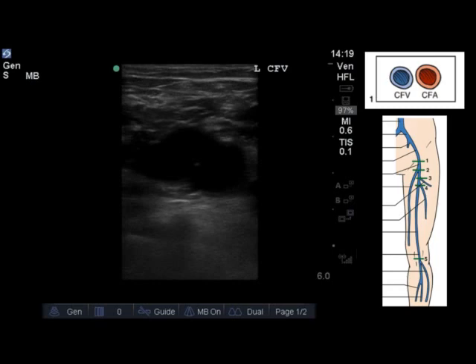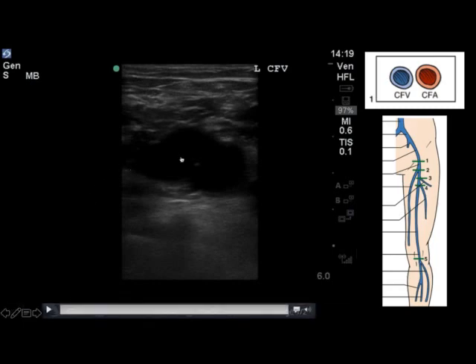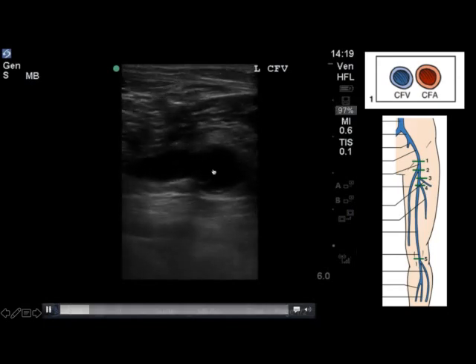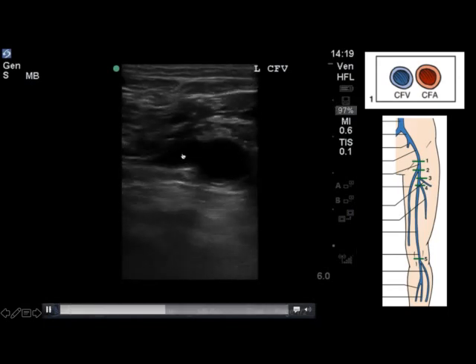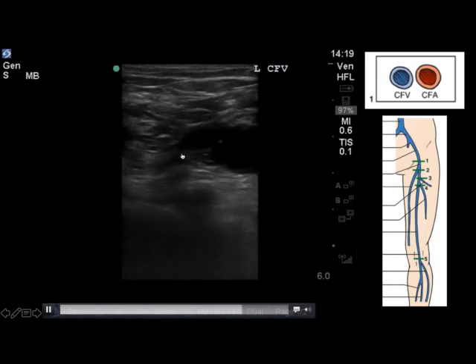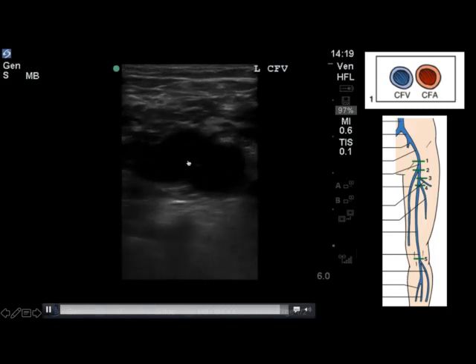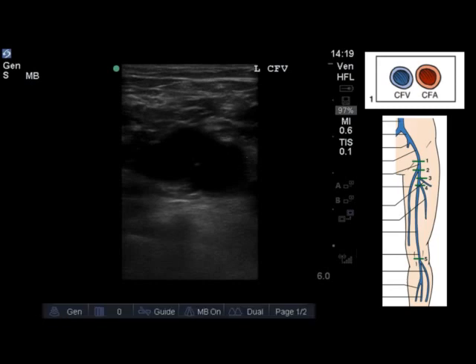The common femoral vein is going to lie medial to the common femoral artery — we have the vein here and the artery here. We're able to press down, fully oppose the walls of the common femoral vein, and satisfy ourselves that no clot is present at this level. You're going to scan every one to two centimeters, compressing all the way along.